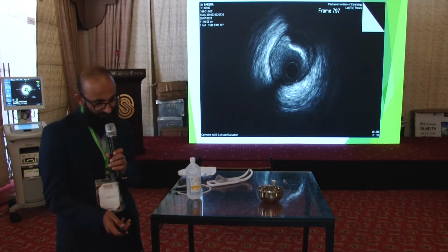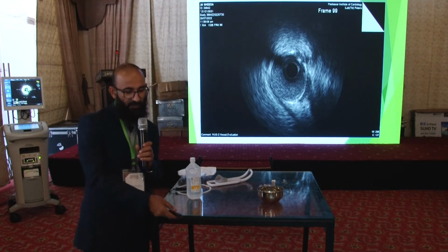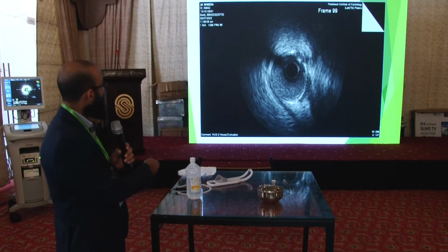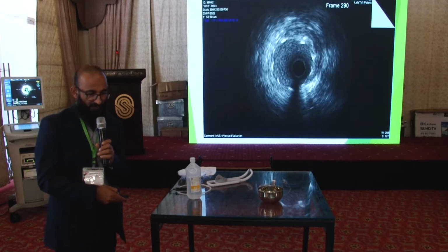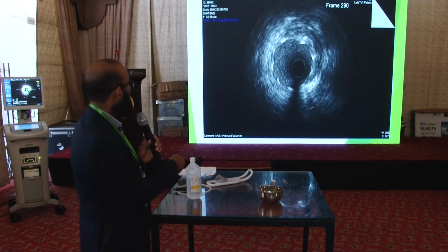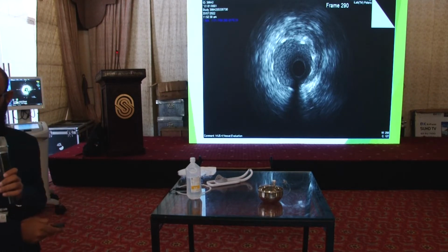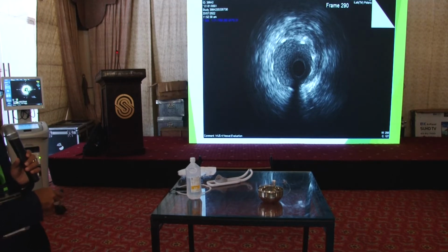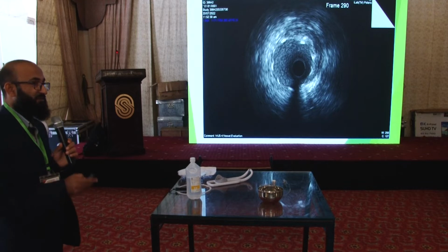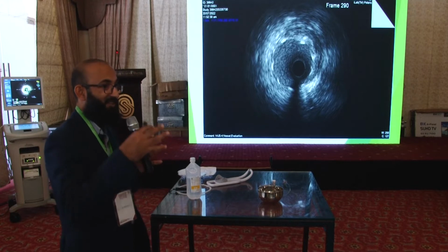Next, please. So I will just quickly go through it because we have other cases as well. So here, this one is the nodule. Next, please. So here, look at this, how we have taken a stent, we have deployed, and we post-dilated that with a larger balloon. The stent was 3.0 and post-dilated with the 3.5, but still, see, there is a lot of underexpansion. So the key message from this was that no matter whatever you do, you can't expand if there is a nodule.